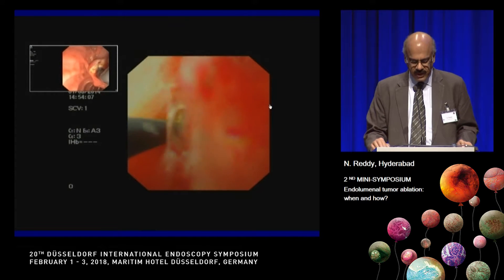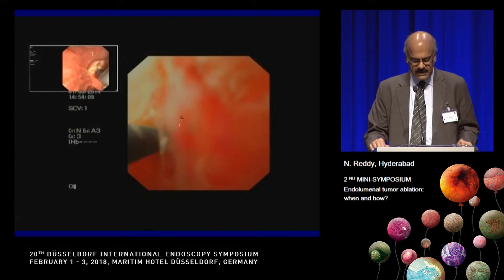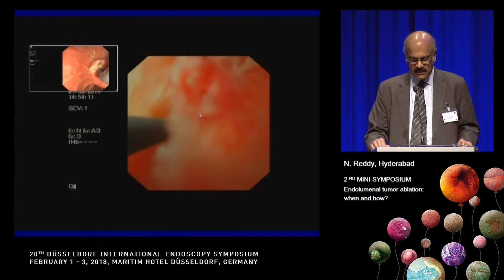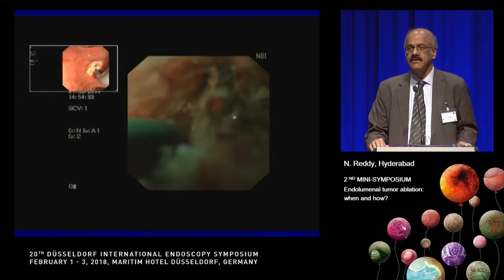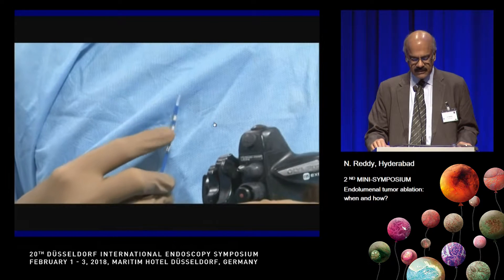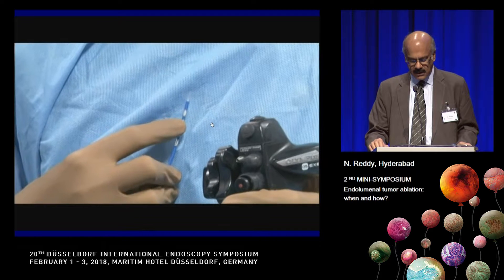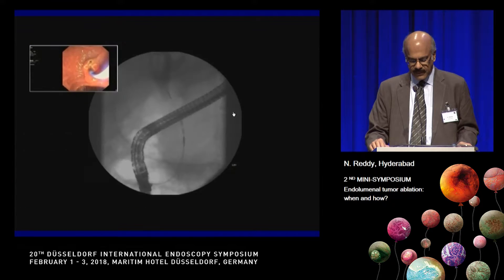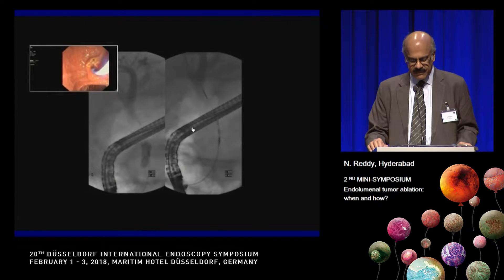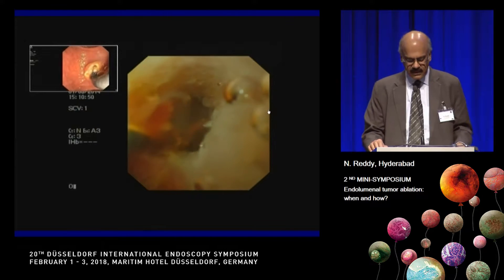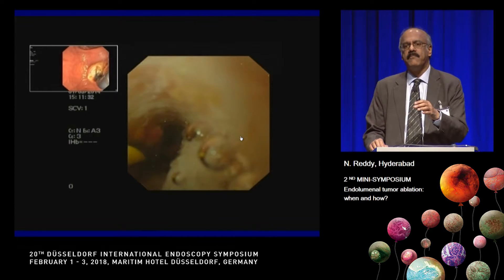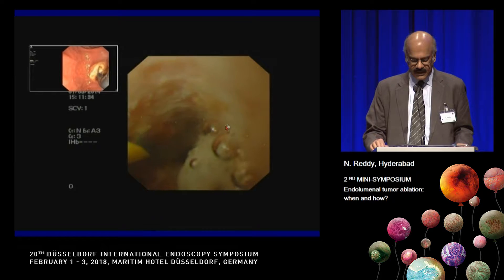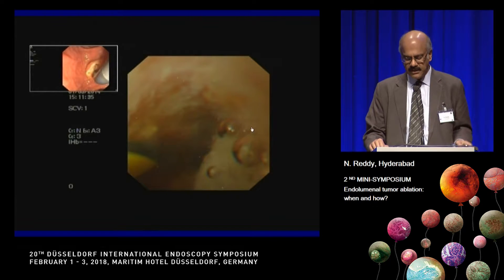This video shows the cholangioscopic picture of a hilar tumor — classic cholangiocarcinoma with narrowband imaging showing very prominent vessels. We then subject this patient to RFA, and when we go back with the cholangioscope you can see a very white eschar, similar to what you see after Barrett's ablation. The tumors are already seen to be opening up.